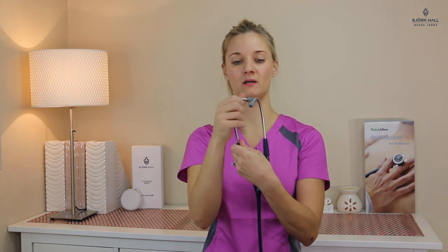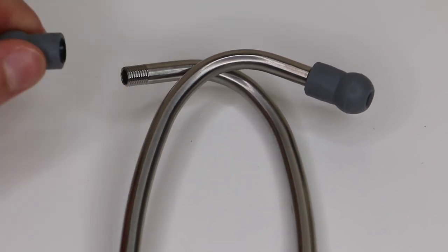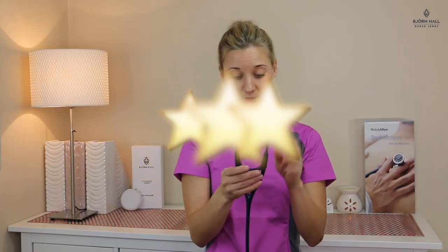Coming up to the binaurals, these are rotatable binaurals — they can rotate all the way around so you can adjust the angle that you prefer for your own ears. The tension of the binaurals you can adjust as well just by pushing in or pulling apart. Then we've got the ear tips that are screw off and on, which in my book is a bit of a negative because you can lose them quite easily. I've given it a score of three out of five.